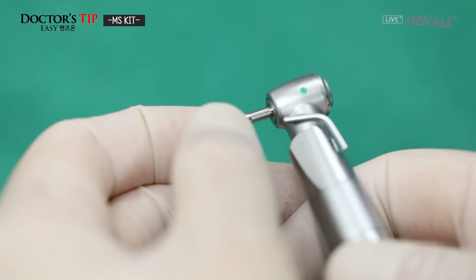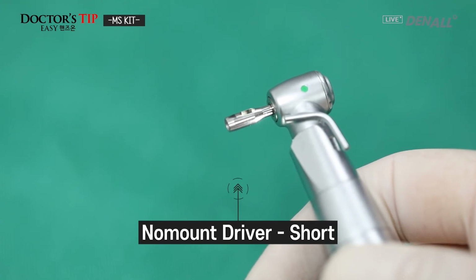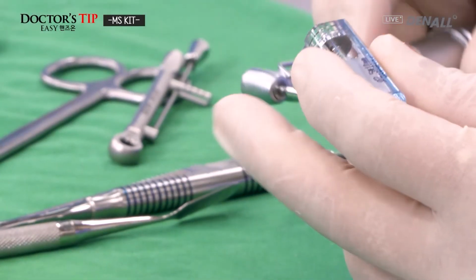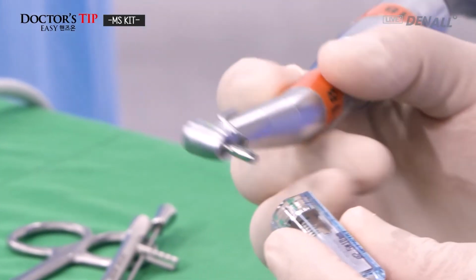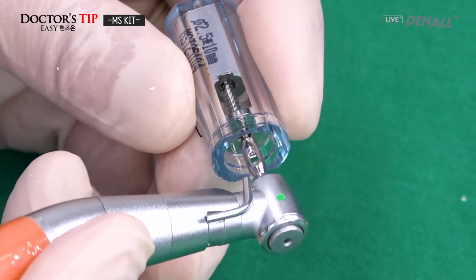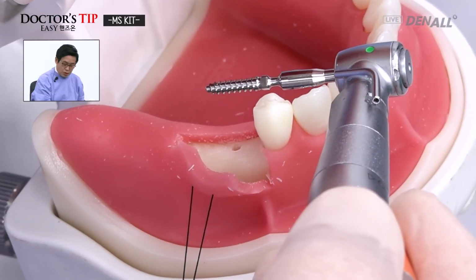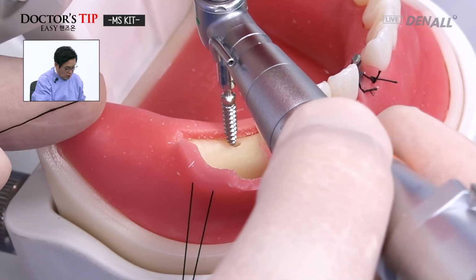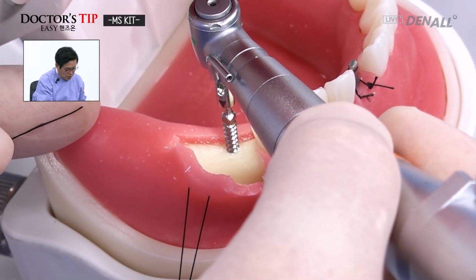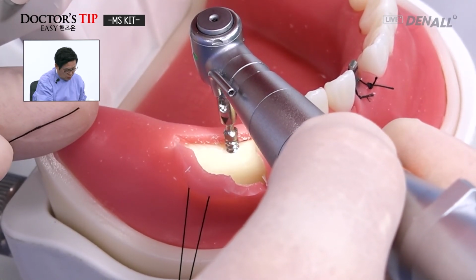And again, change the mode for placement. Open it. Same again. Even if it's provisional, the marked area connects to the flat area of the fixture. And check the mode, whether it's the correct mode, and then place. I intentionally, as I said, gave the angled position. Like this.